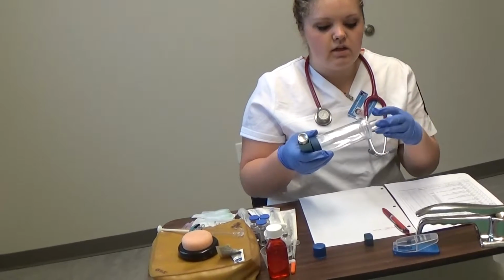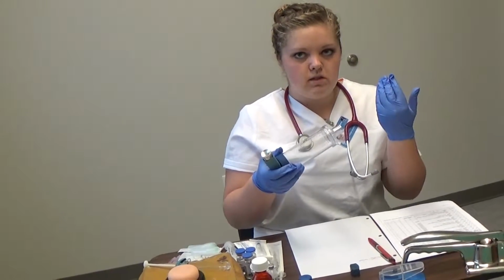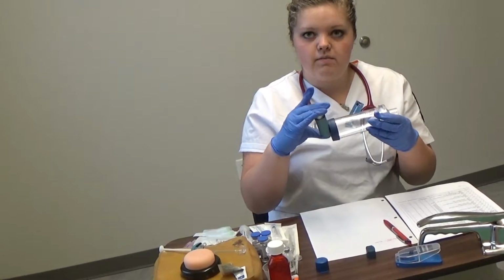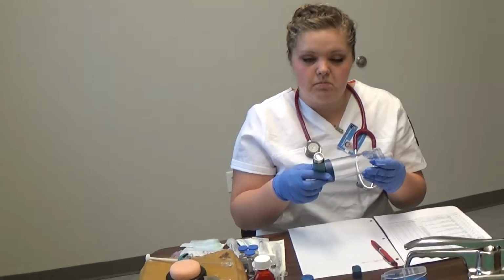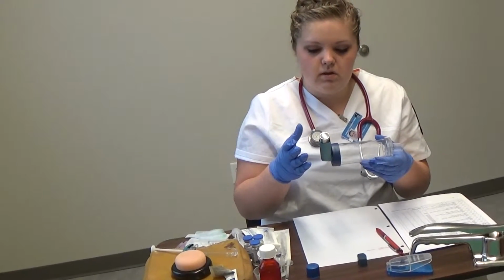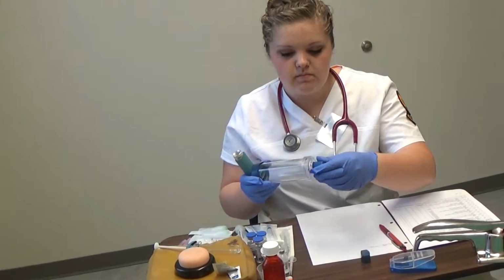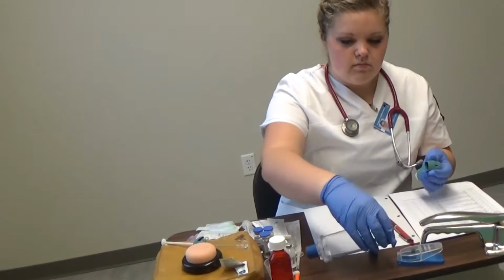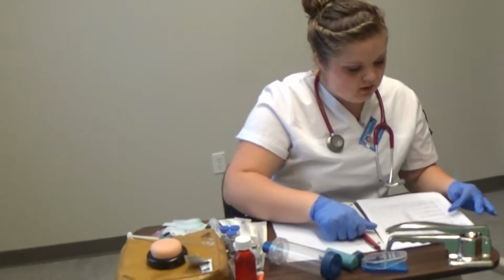Do a nice big exhale, create a nice tight seal here with their lips, and then take a nice deep breath as they push this and inhale it in. So they can get it all down into the bases of their lungs and really get the full effect of the medication. I would then wait a full minute and then let them do it once more, because it has to be done twice. Alright, so we've done that one.